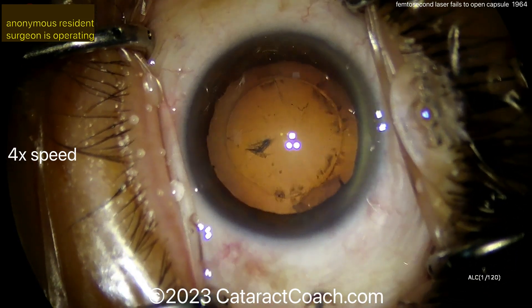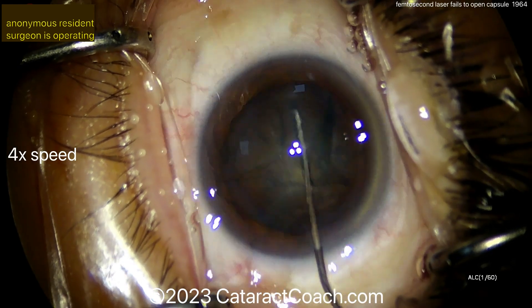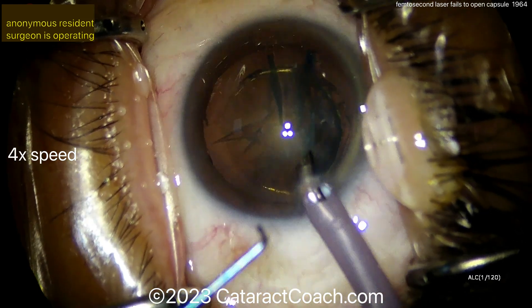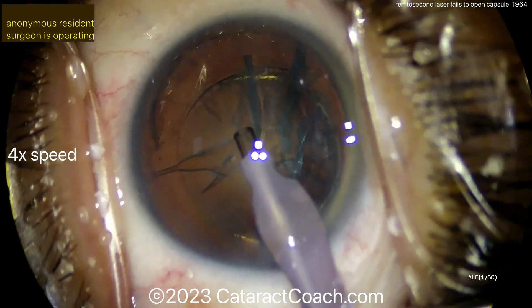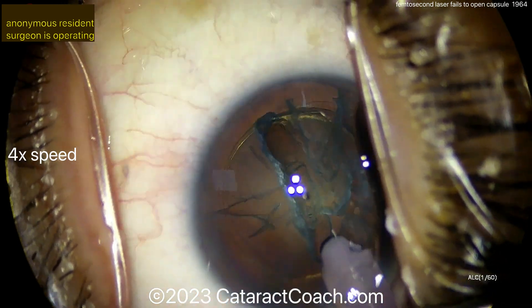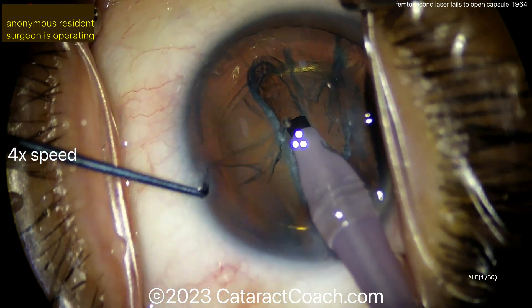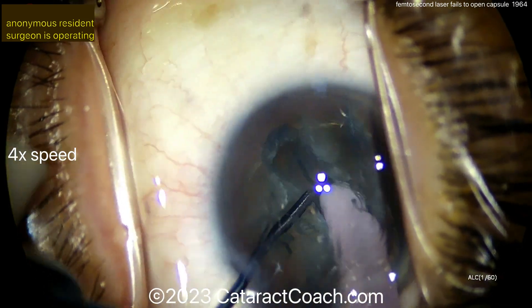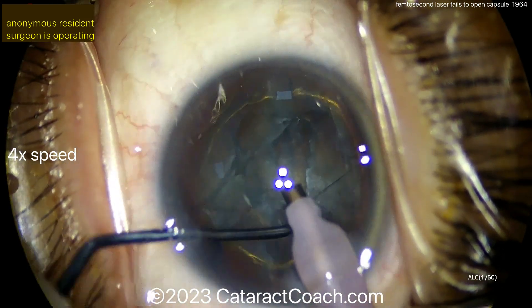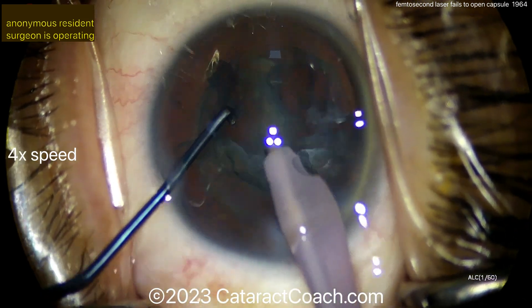Be careful not to exert too much force on the capsule in case there are any weak spots remaining. We'll speed the video up to four times normal speed. There's the cataract, hydrodissection done, there's a golden ring of delineation, here comes the phaco probe. The technique is a groove down the middle — maybe a stop-and-chop or divide-and-conquer. It looks like a pretty moderate nuclear density. Once the groove is done, crack down the middle, rotate, another split, and then stop-and-chop — very nice technique.